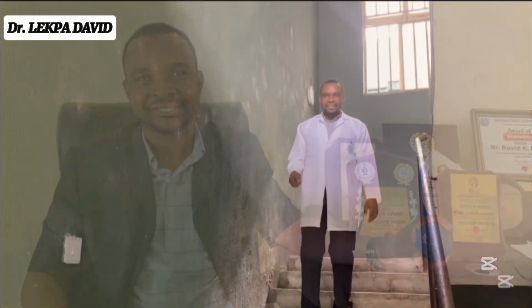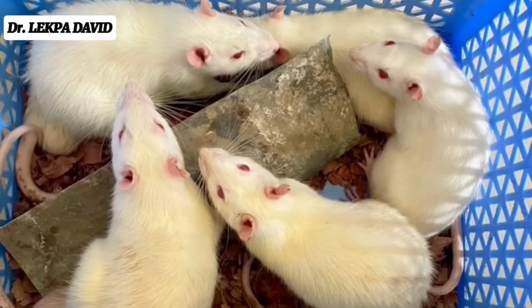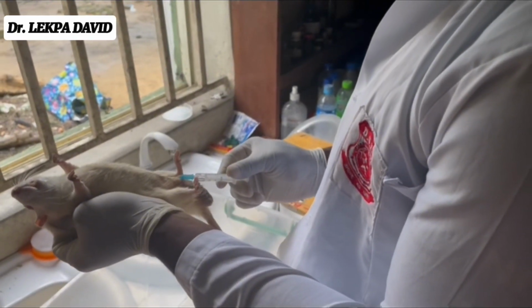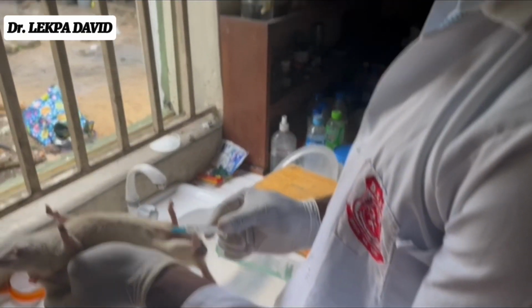Join me as we go to the lab where the experiment is performed: craniotomy experiment, survival surgery. Rodent experimental stereotactic surgery. They were using 20 rats for this procedure. Now you can see me here giving anesthesia, which is very important in this procedure. I'm using ketamine.